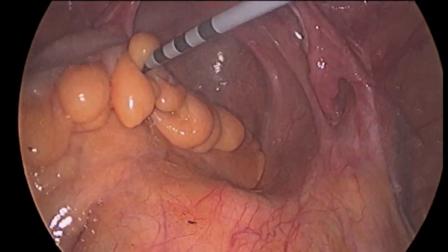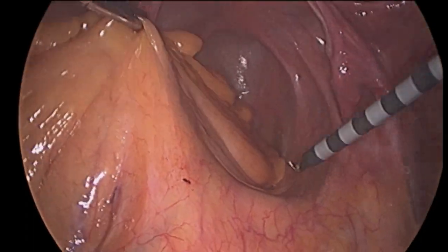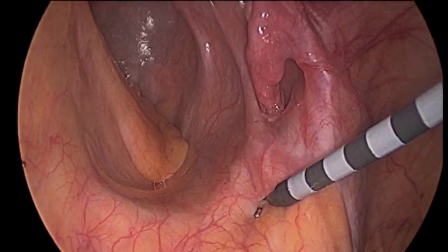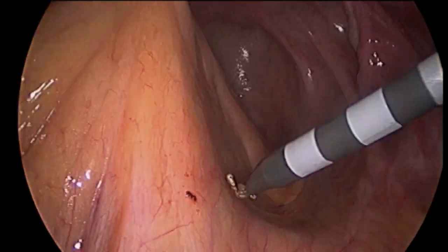Here we see the right ureter being identified prior to dissecting the right side of the mesorectum. The end of the right fallopian tube is visible, just above the tip of the cautery instrument.